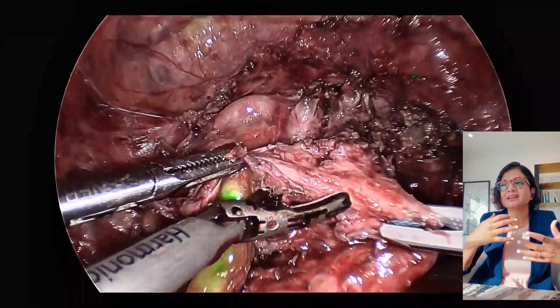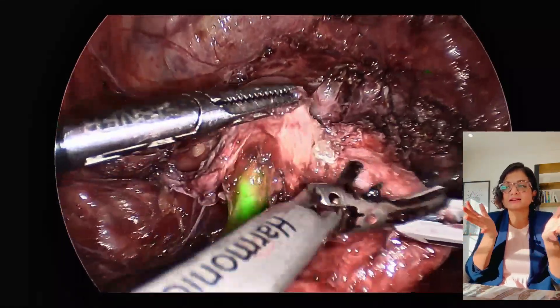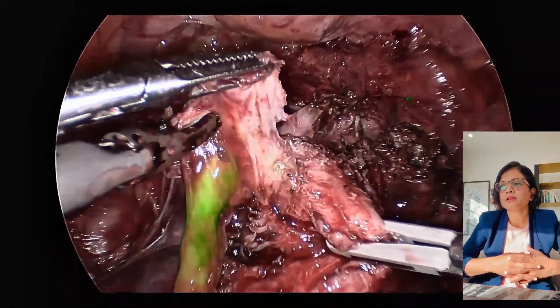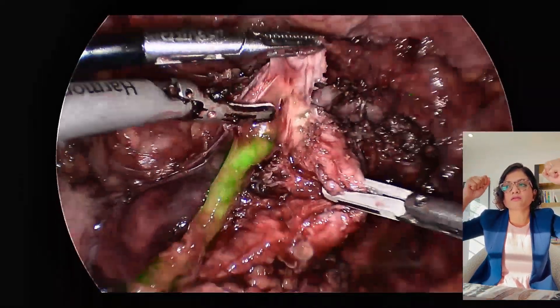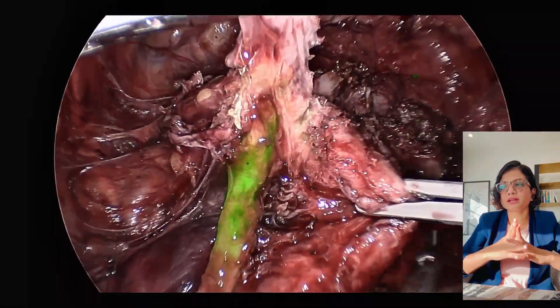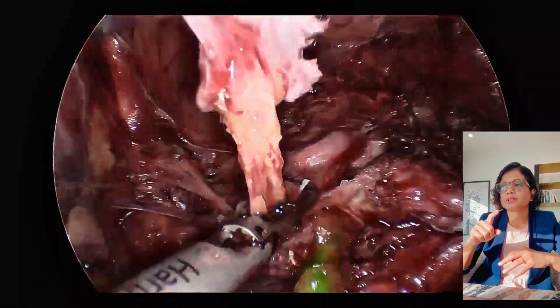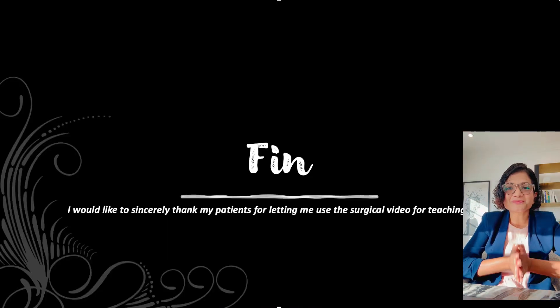Now I've come to the roof of the ureteric tunnel. I really want to free it up because if left alone, endometriosis lesions have their own hormones being produced — they can proliferate and encompass the ureter, causing hydronephrosis and hydroureter in the future. So we really want to open this up and excise that nodule. It's anterior involvement of the posterior compartment — the roof and lateral aspects of the ureter are usually involved, while posteriorly they're usually free. Gently use your dissecting technique, don't use a lot of energy, and lift it away from the pelvis to increase the distance between your working instrument and the ureter. There's always an artery that comes up here, so be mindful. Once that's done, you can actually see the uterine artery just behind it — we take this nodule and it's taken off. Thank you for your patient watching, I'll be back with more.